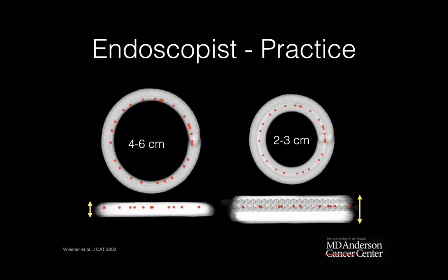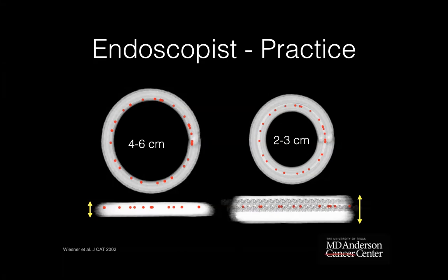That is not as effective as taking the biopsy port out, but I want to make sure that I'm cutting in a decompressed colon. And that is also helpful to avoid tension pneumoperitoneum in case a perforation were to happen with a colon loaded with a lot of air or gas.